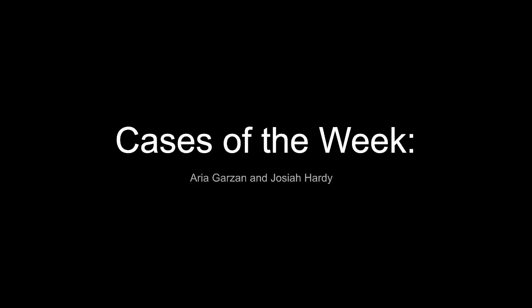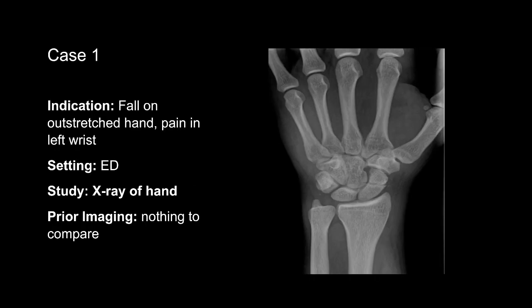This week we'll be focusing on MSK. So let's go ahead and dive right into it. This is our first case of the day.